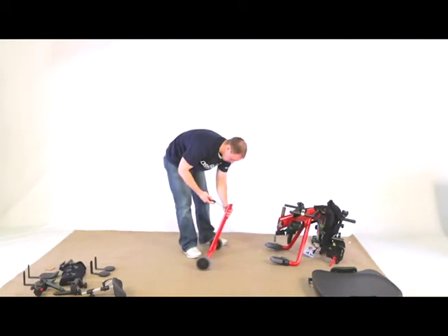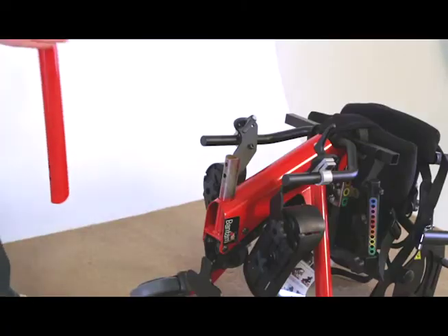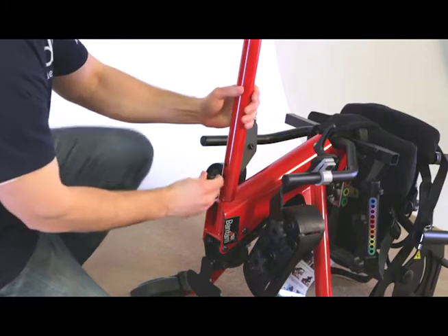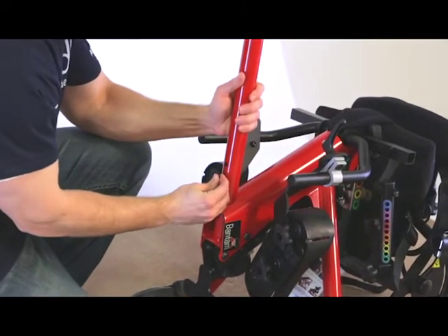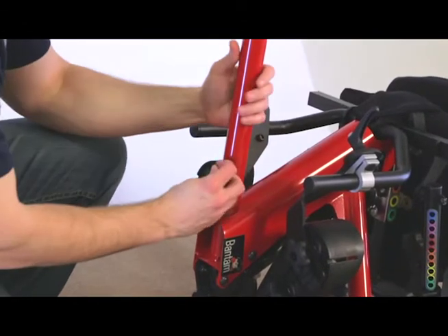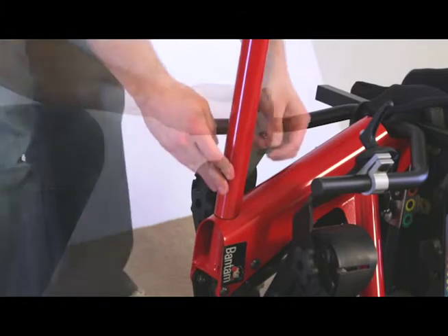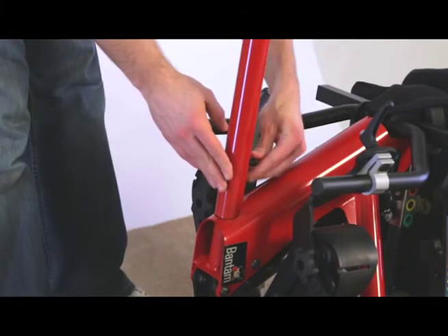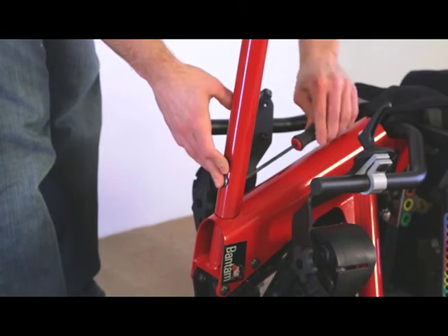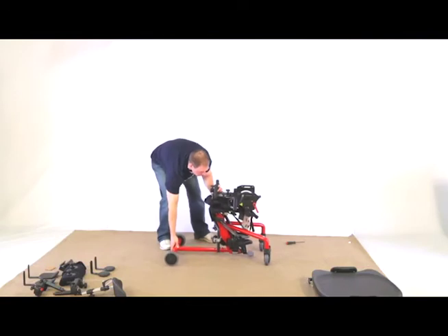Remove the 2 bolts and 2 coved nuts from the front wheel assembly. Place the front wheel assembly onto the seat assembly with the holes of the axle facing towards you. Place the 2 coved nuts into the bottom of the frame, making sure they are flush with the tube. You may have to tap them with a rubber hammer to make them flush. Place the 2 bolts into the top of the frame and screw into the coved nut, making sure they are flush. Tighten securely. Place the unit back into the normal position.